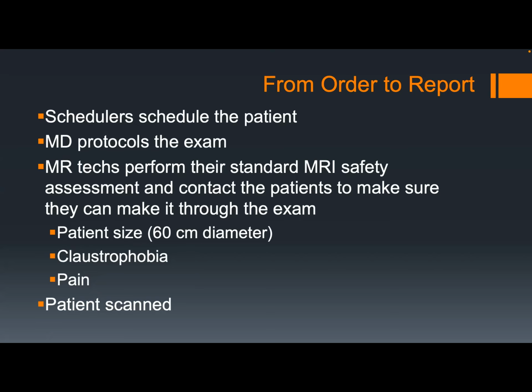Sometimes the patients are really big, and so we will actually fit test them. So we'll have the patient come in and see if they'll fit in the machine. We've rarely had patients that come that are too big, and sometimes we can switch them to PET-CT the same day. Sometimes we just have to say, I'm sorry, we can't do it. Then once all of this is done, the patient gets scanned.